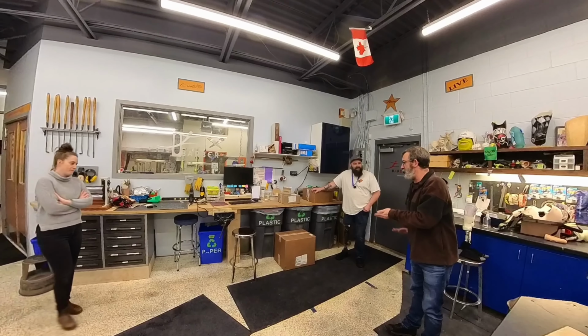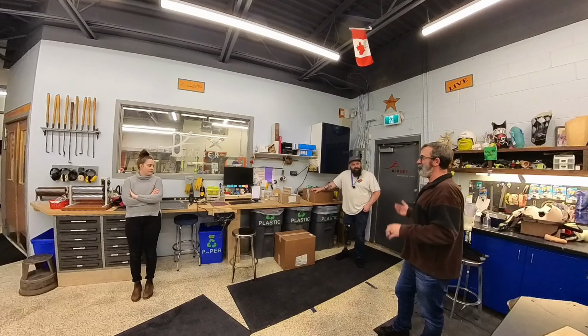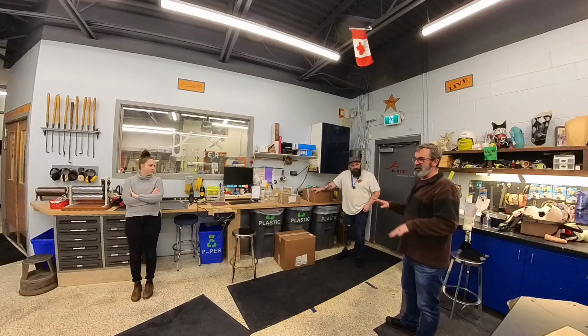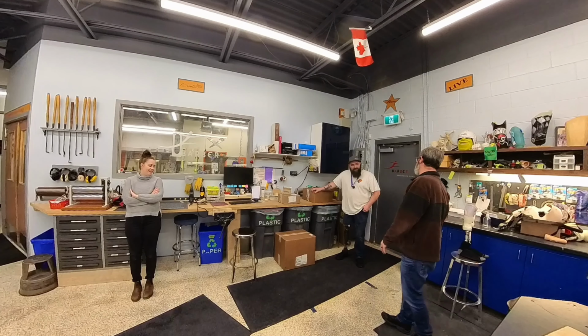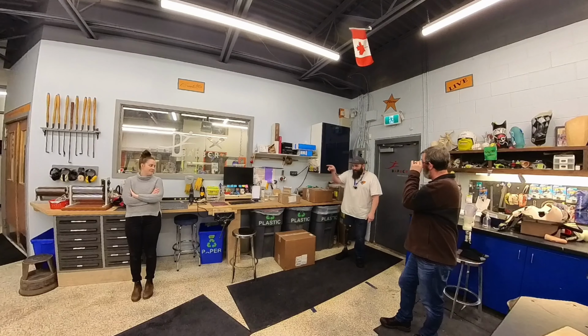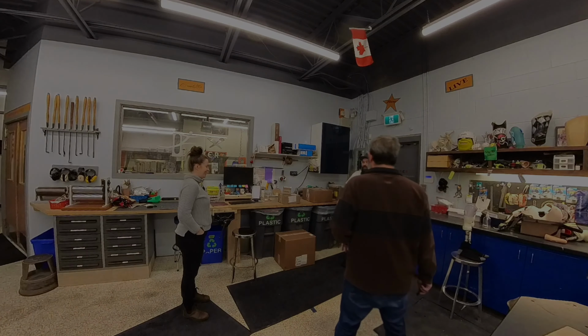And now the inside of the shoe is not right because the camber's out. Depends how you walk, right? And then all of a sudden you've got the shoes that are like this, and then they change the shoes, and then the leg's totally screwed. And then you guys are chasing, trying to do adjustments. But see, I brought these shoes just for you, because I personally didn't bring my boots, and if I got stuck in the mud today, I was going to blame you.